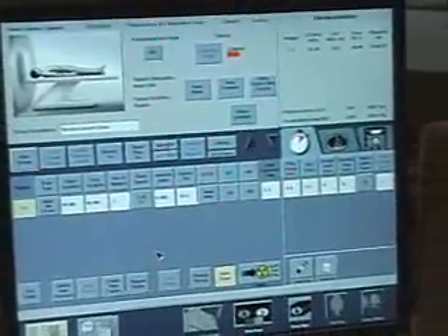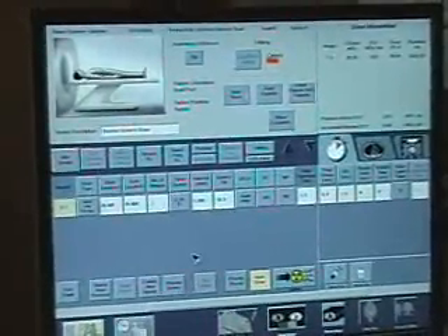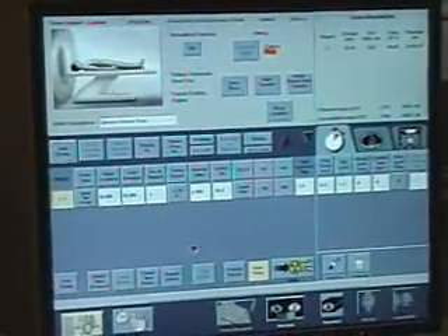Is all of this done before you start aligning the lasers? Yes, this is all done before we even start the install. Because what we have to do is put a laser level on the phantom and shoot the walls. We need to know that the phantom is exactly mimicking isocenter, 600 millimeters from the real isocenter.